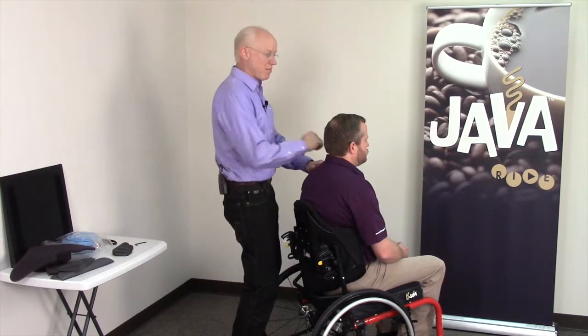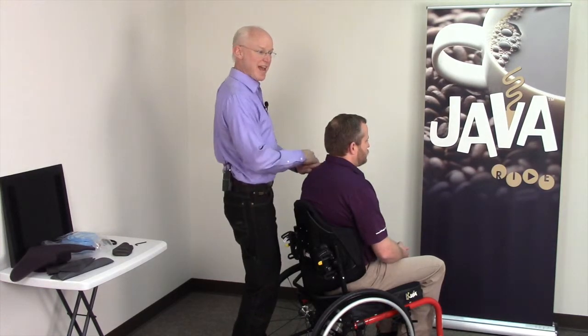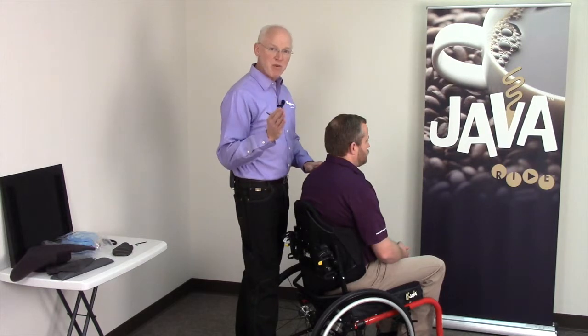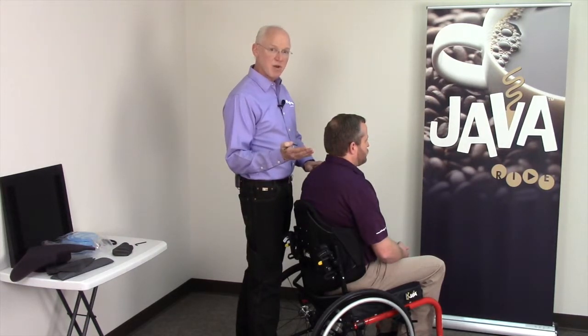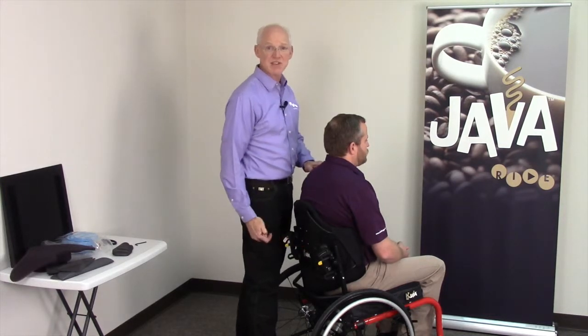The pelvis, if you look at my pelvis and trunk in flexible presentation, like Ryan has, the pelvis and trunk work opposite of each other. A good back support will give you a tool that will allow you to optimize the pelvis. We just did that through our back height, putting the pivot right at his PSIS's.